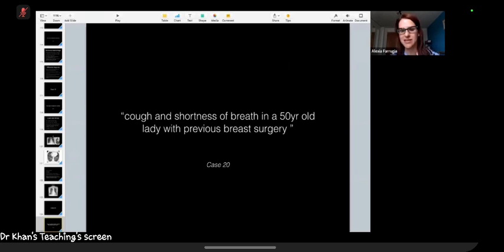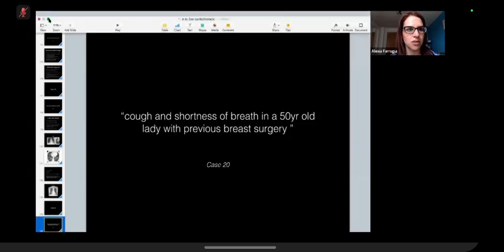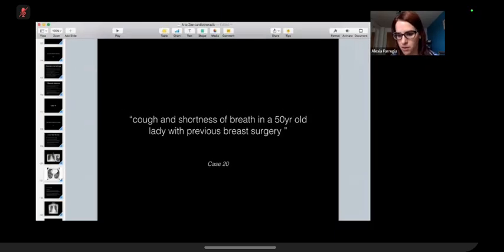Okay. So this is your history. It's cough and shortness of breath in a 50-year-old lady who had previous breast surgery. So we'll prepare your images and I will share the screen in a bit.